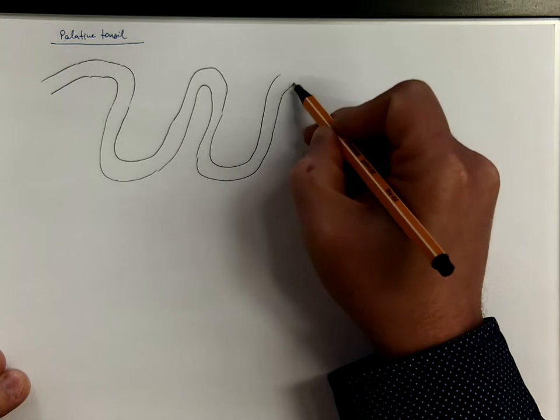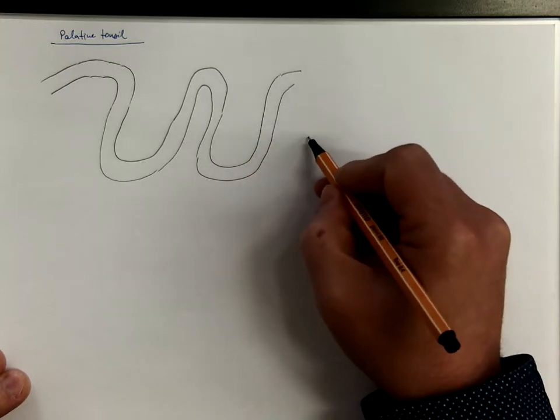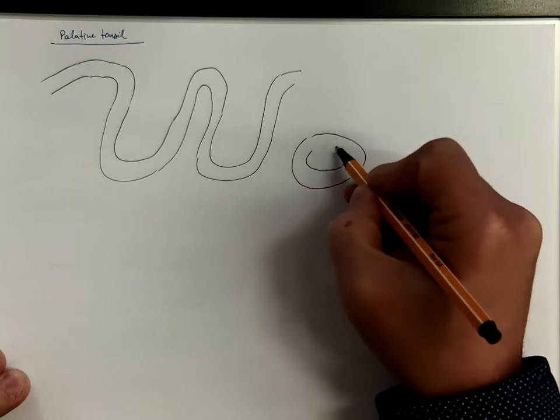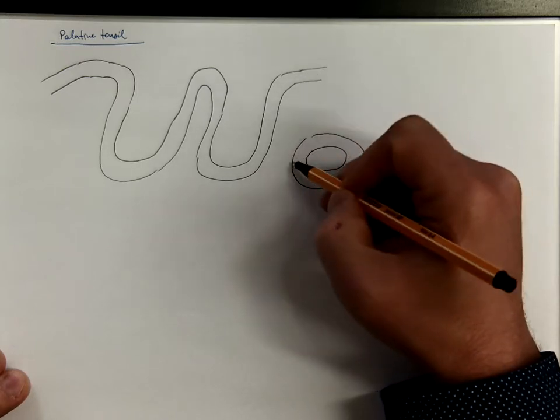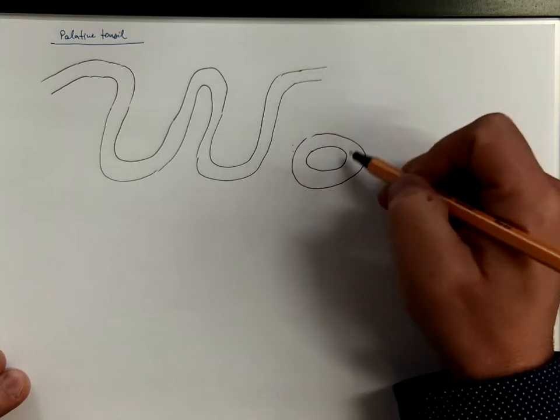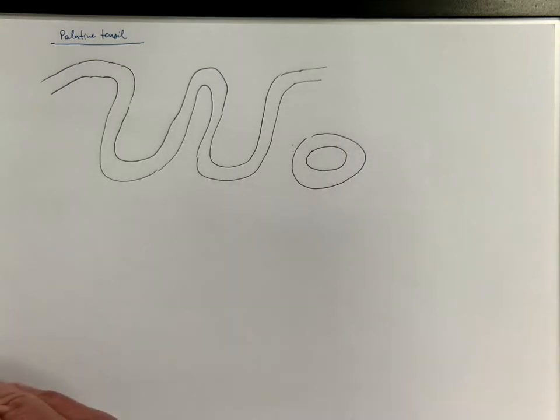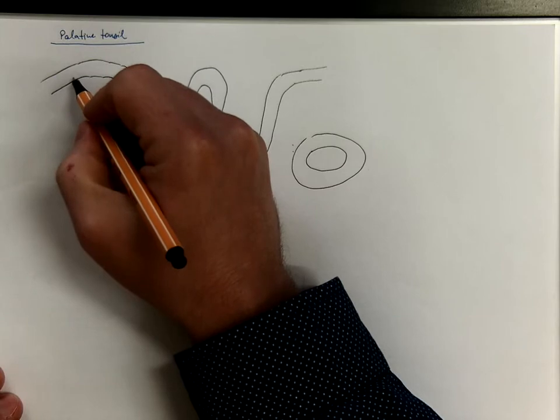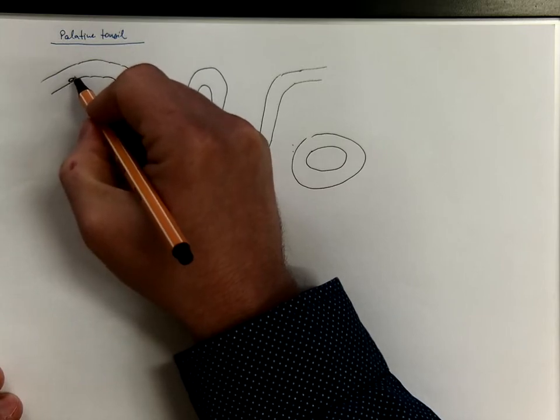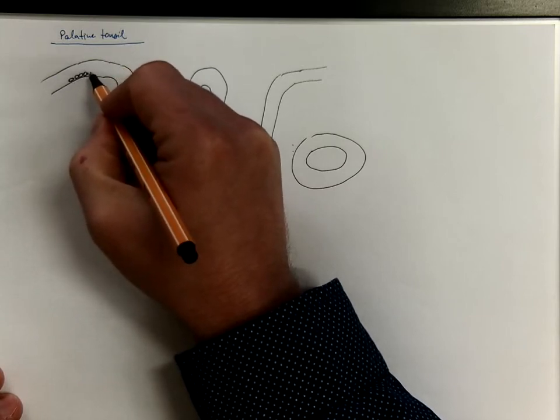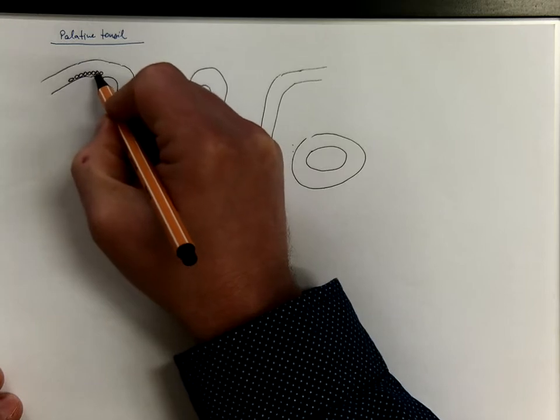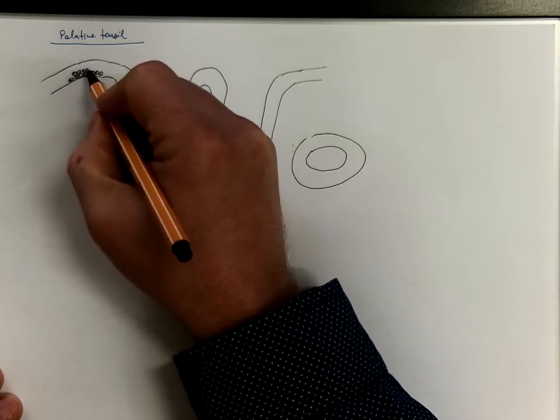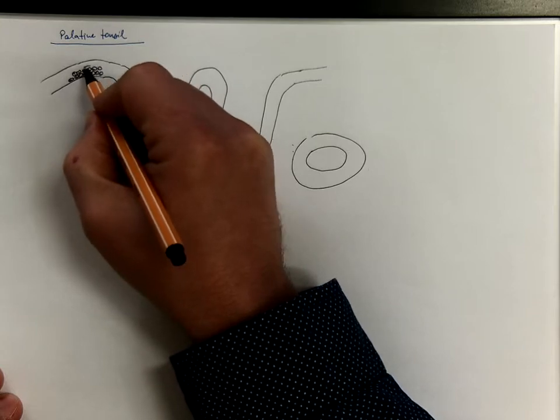Sometimes you can find the bottoms of these crypts also on cross-sections, like here, where you really don't see the connection to the surface, but there is in the three-dimensional space. The epithelium is the same as in the pharynx, so it is a stratified squamous non-keratinized epithelium.